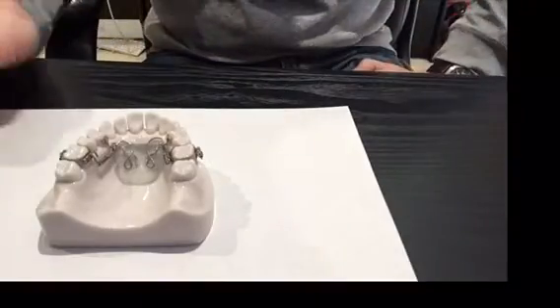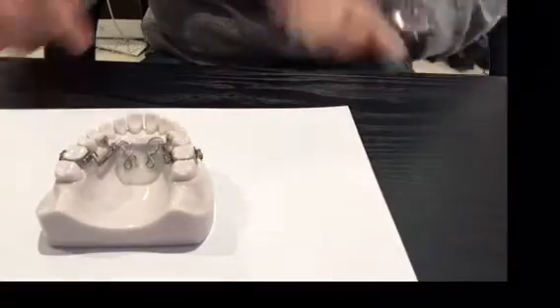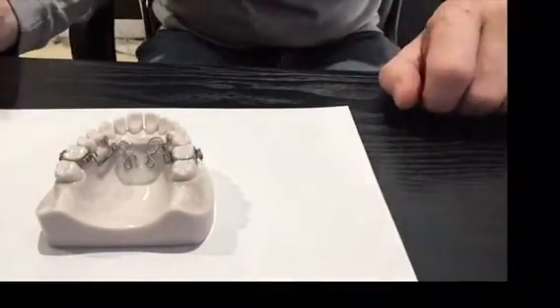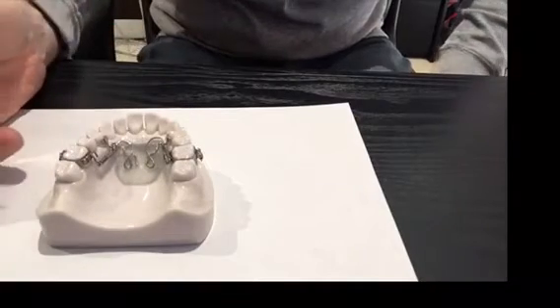Hi, I'm Graham Manley from Ortholab and today I'd like to show you how to activate a distal jet appliance. Here's the distal jet appliance — this is an appliance that will distalize the first molars. It is a fixed appliance and it's activated by means of this little key here that comes with the appliance.